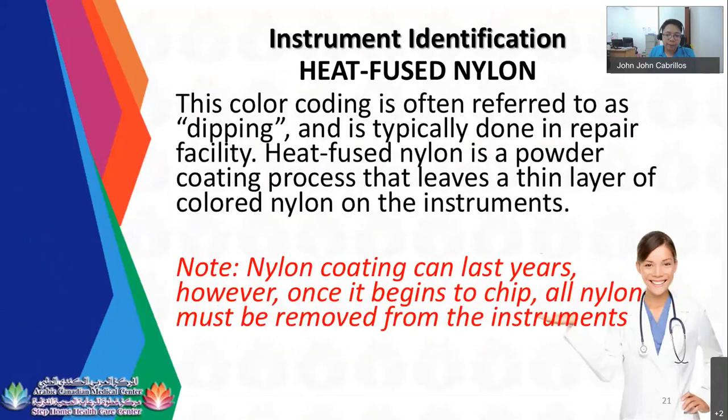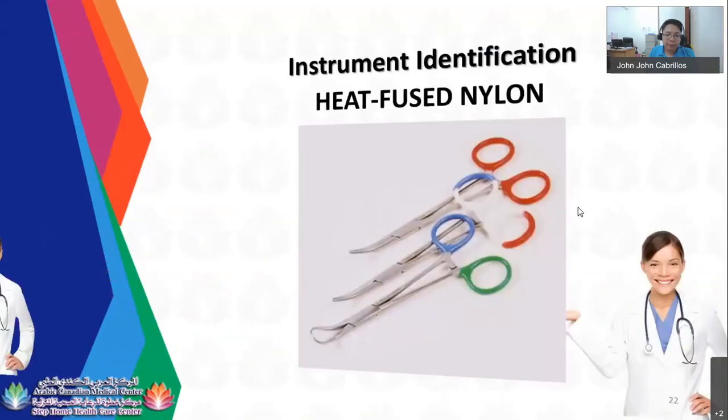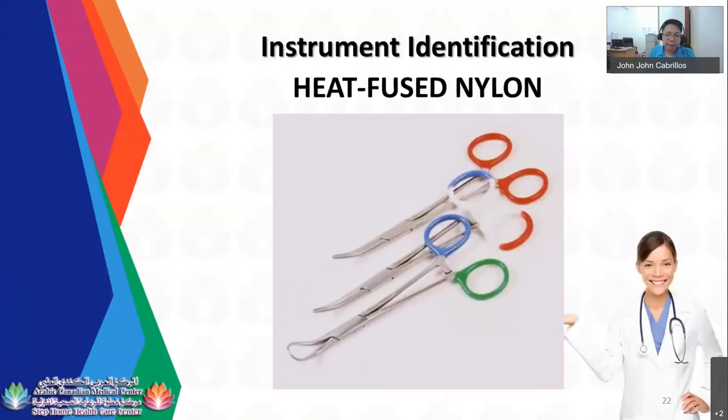So there are different types of instrument identification. The other type is heat-fused nylon. This color coding is often referred to as dipping. So they will dip the instruments in a certain nylon coating, then it will coat with color-coded nylon. So heat-fused nylon is a powdered coating process that leaves a thin layer of colored nylon on the instruments. So nylon coating can last years. However, once it begins to chip, all nylon must be removed from the instruments because it can cause infection to your patient. This is your sample of your heat-fused nylon.